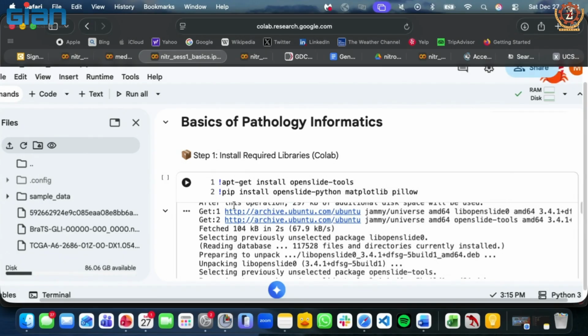So what you do is you put a needle through the skull, or there are different techniques, but you do a needle biopsy or an open skull biopsy depending on the patient. Put a needle, get some tumor sample out, slice it, put it under a scanner, and get the histopathology slide. So that is basically, for one patient, the histopathology slide in this SVS file.